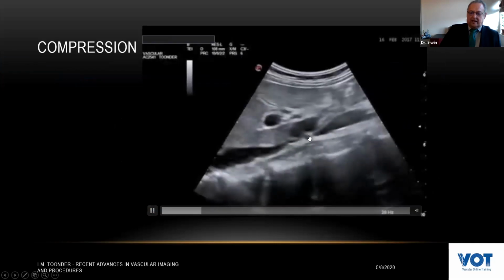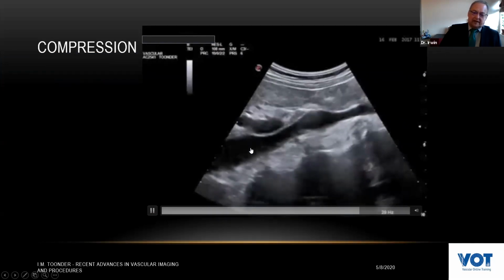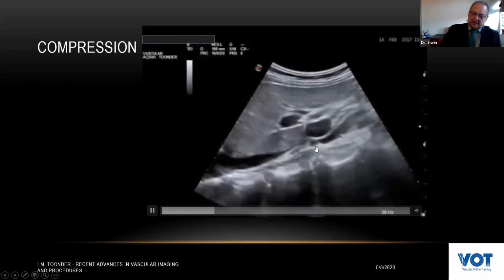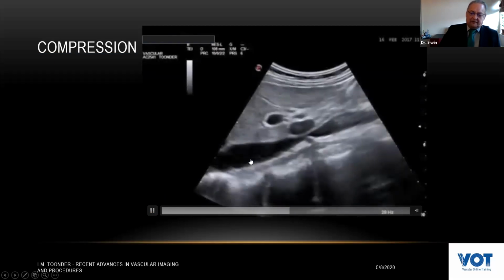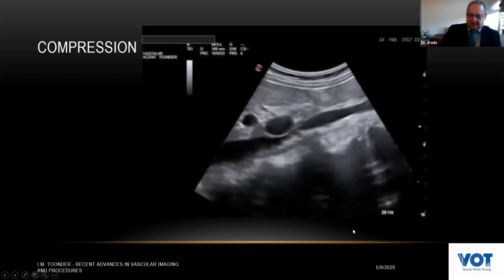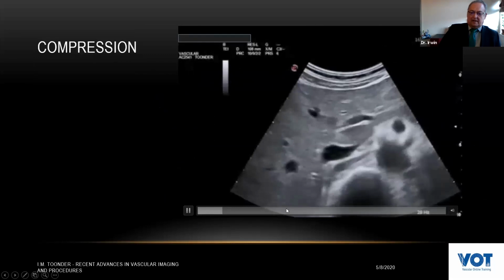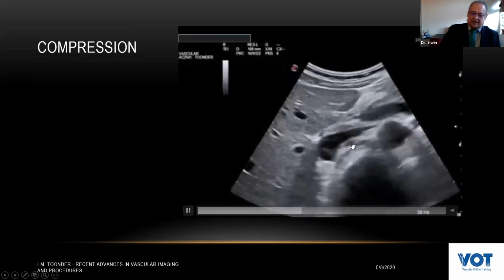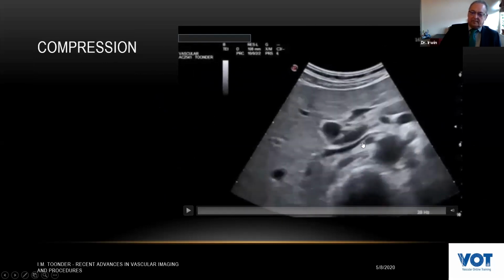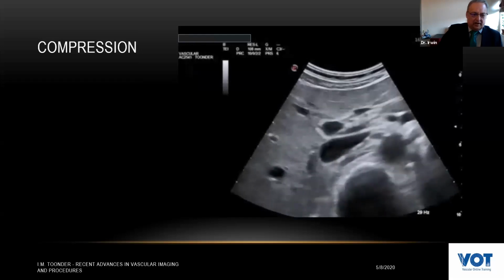And sometimes you can see here at the level of the splenic vein interacting with the level of the renal artery, and you can see what the effect is on the blood flow, that it becomes more echogenic as the compression is active and releases. And you can see what the effect is on the blood itself. So definitely in this story, there's some compression, and this is in the transverse plane. And we talk about nicely shaped and commonly sized vessels, but the vena cava itself, and I'm taking this vena cava at the level of the liver, you can see that there are branches coming in, deforming the lumen. It's not just about tubing; it's not as simplified as that.